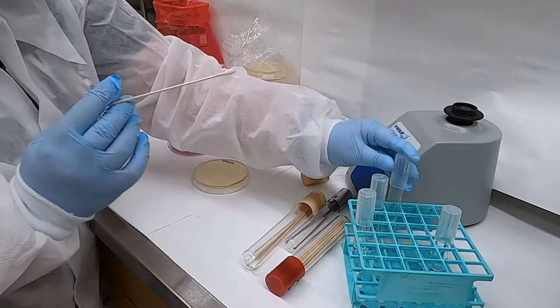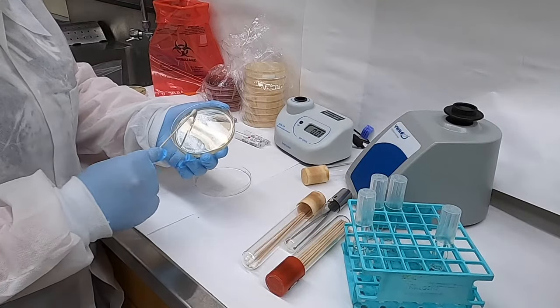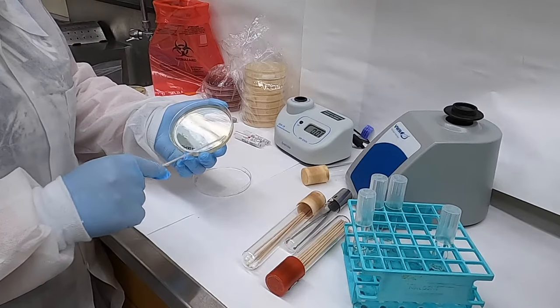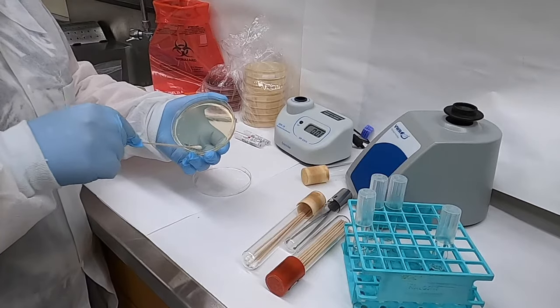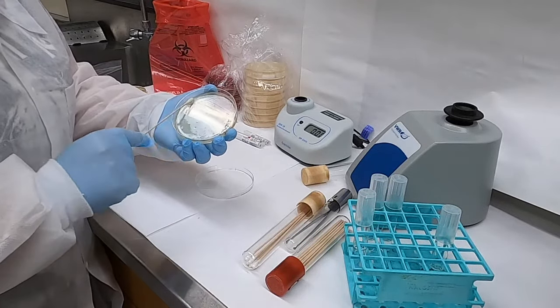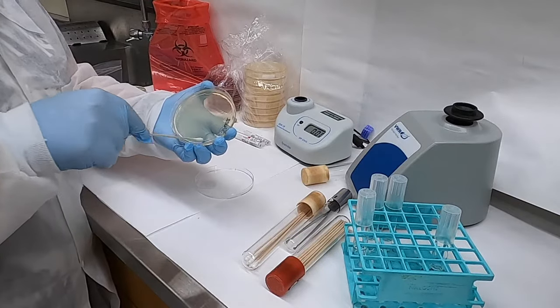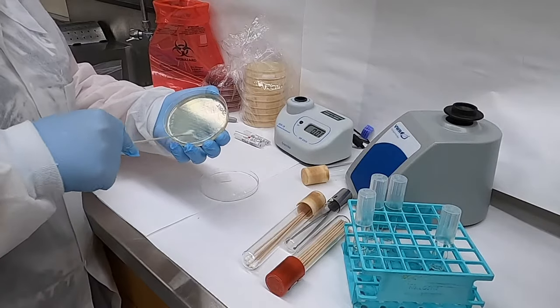This swab is then used to plant a lawn of bacteria over the entire agar surface. As you can see here, we spread the swab from side to side, rotating it, covering the entire surface of the agar plate. The plate is then rotated 60 degrees and that swabbing repeated, and then that's repeated for a third time just to ensure that we have a homogeneous lawn of organisms.